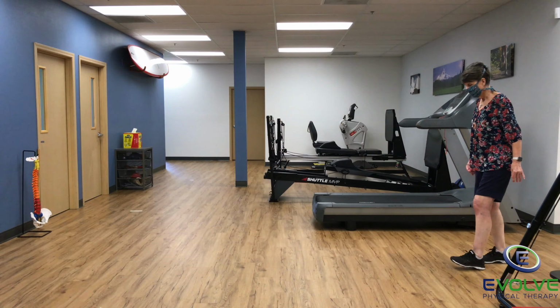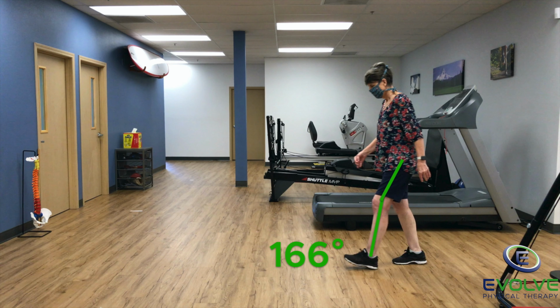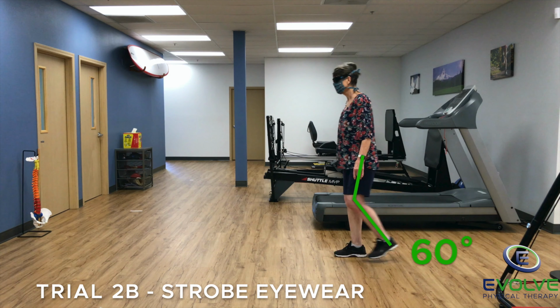After leg press, knee flexion improved by 8 degrees during mid-swing and 2 degrees at initial contact compared to the very first trial. Once again, her knee range of motion improves with the Strobe Eyewear.